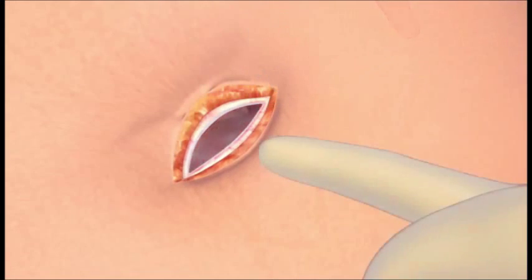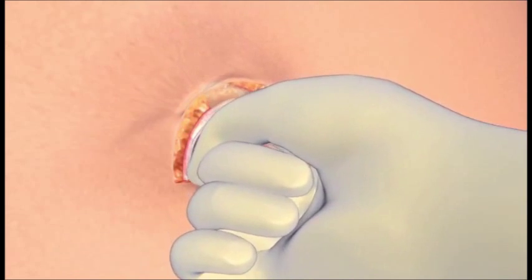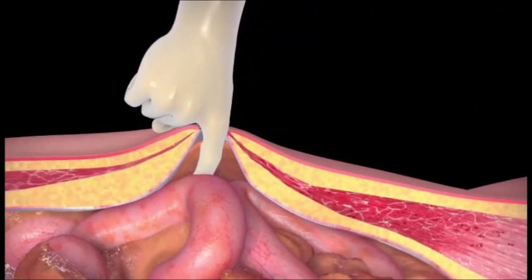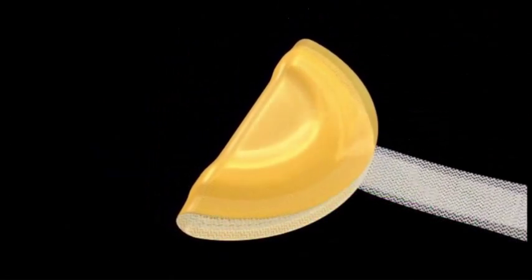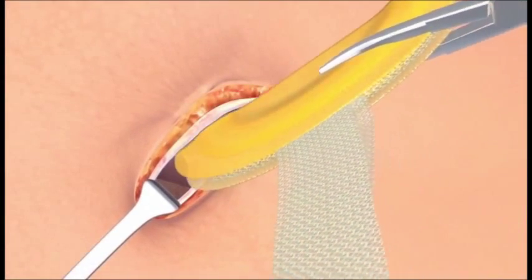Make sure to clear the space around the defect and dislodge any adhesions in order to make space for the v-patch to deploy. Fold the secure v-patch with the smooth side facing outward and insert through the defect with fingers or sponge forceps.